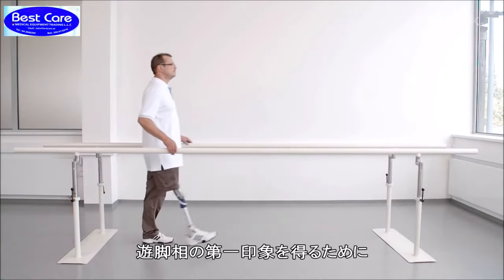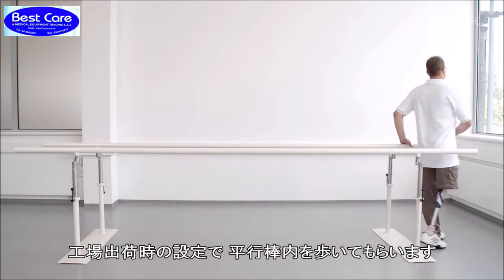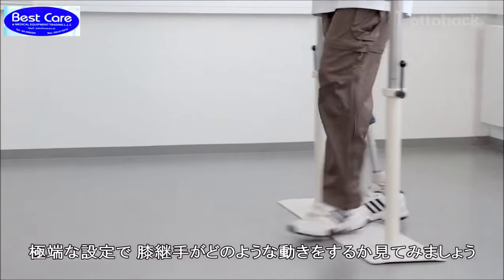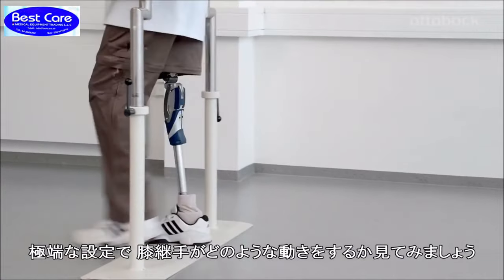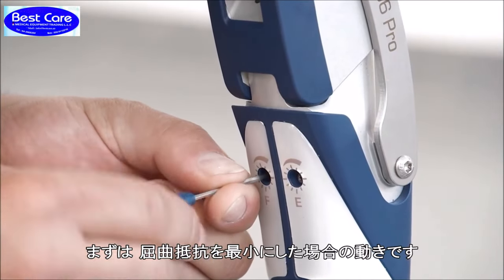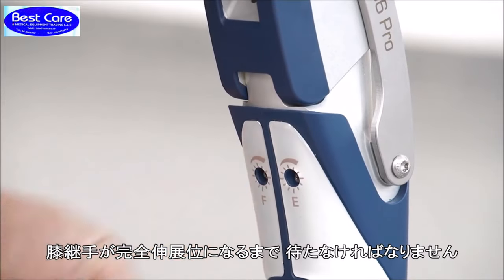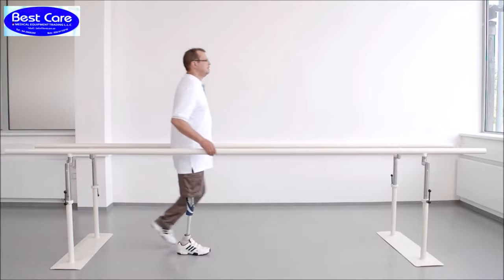To get a first impression of the knee joint's swing phase control, have the patient walk in the parallel bars with the factory settings. The following video sequence will demonstrate how the knee joint reacts to the extreme setting of the swing phase damping. At this point, the flexion damping is shown at its minimum. At higher walking speeds, the user has to wait too long for the prosthesis to reach full extension at heel strike.